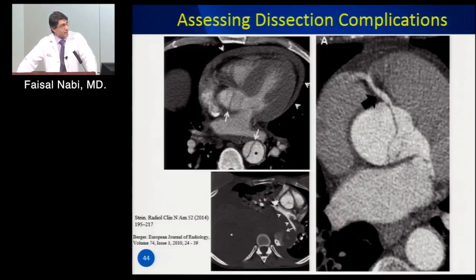One, you have evidence of fluid within the pericardium, always an ominous sign. Eric, this patient is hypotensive and has a dissection. Do you tap this fluid to save his life? Okay, yeah, that's correct. If you do a pericardiocentesis, you will drop the resistance to blood extravasating from the aorta, and the patient will really just continue to bleed to death. So do not tap these patients. The treatment is straight to the OR.